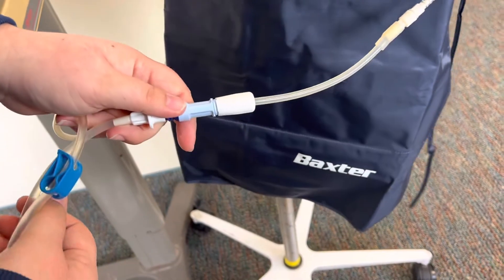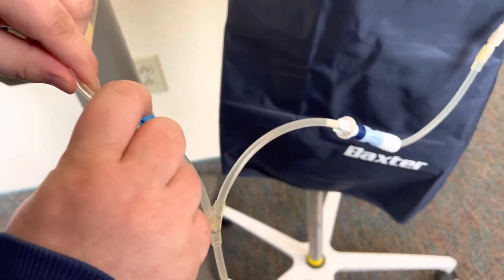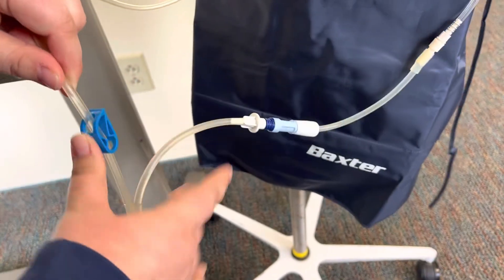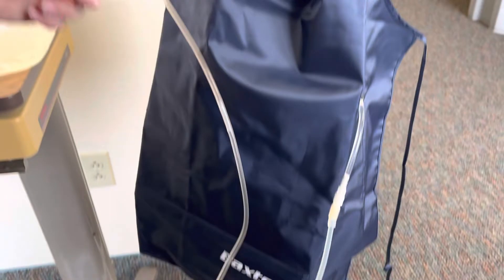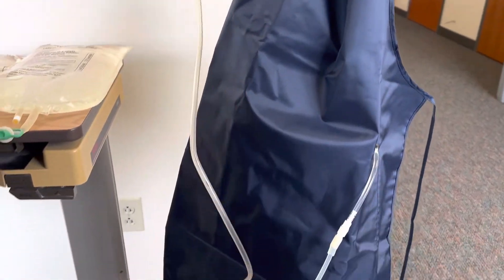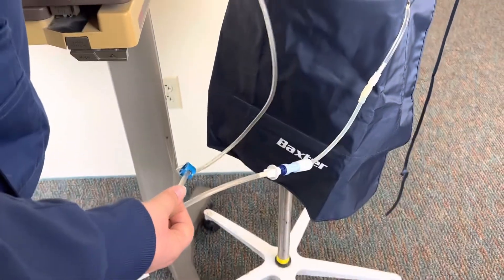We're going to open up our catheter here with the transfer set and unclamp this blue piece — the longer tubing — and then you should start to see that solution going into their abdomen.